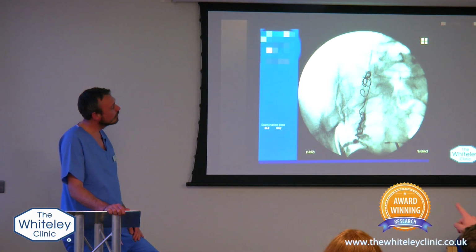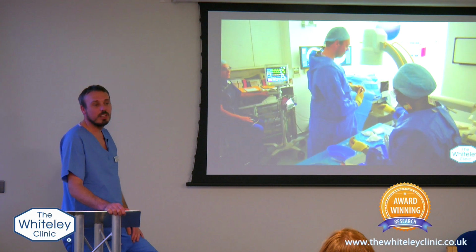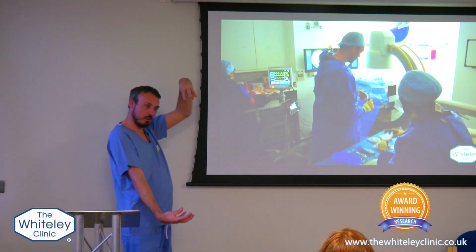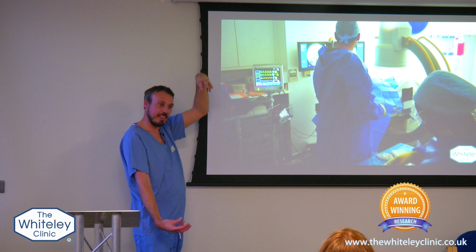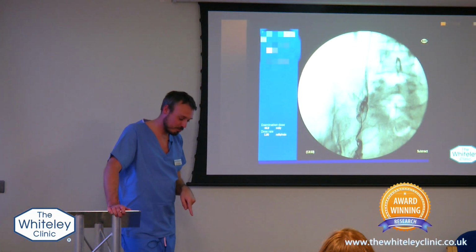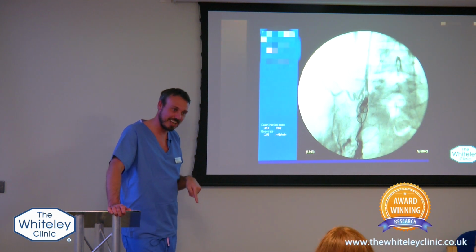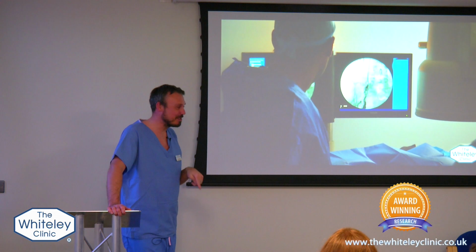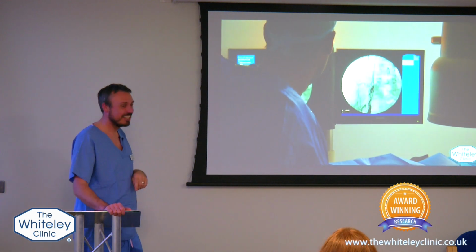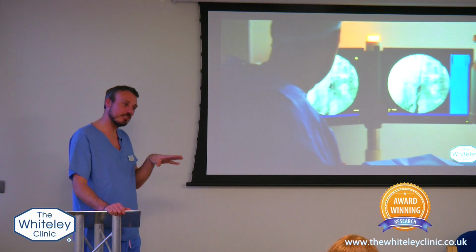Is the shape that the wire is now following, is that following the shape of the vein? It's just following the overall shape of the vein, but you're not going to have this beautiful coiled symmetrical spring. So you know, coming up the vein. It doesn't look like from that shape that it's going to stop liquid, but it's the vein clamping around it. Exactly. It's the fact that it's a foreign body.